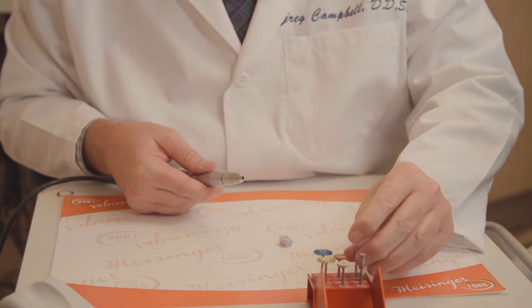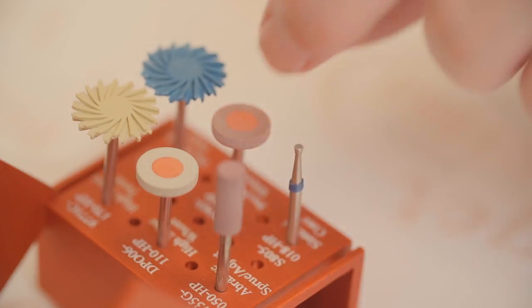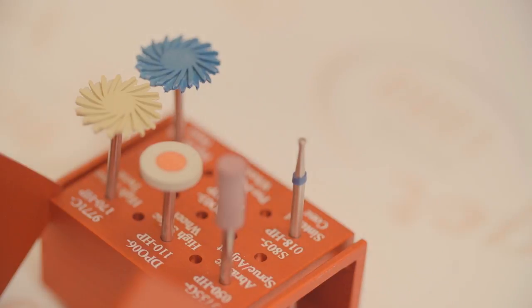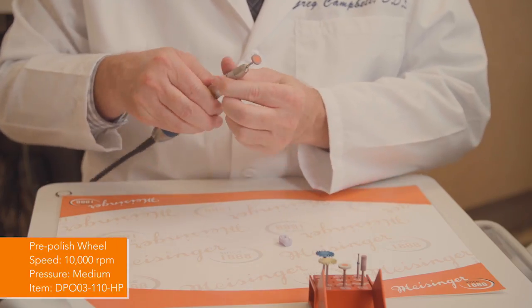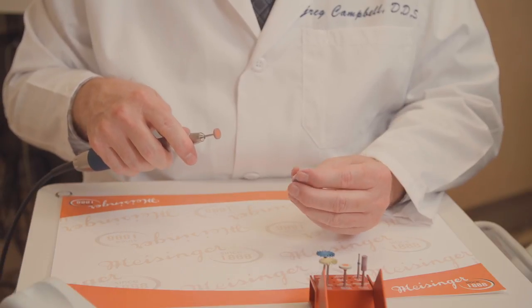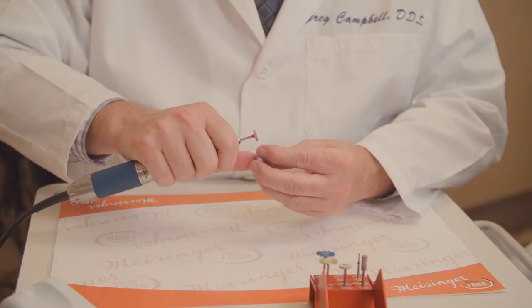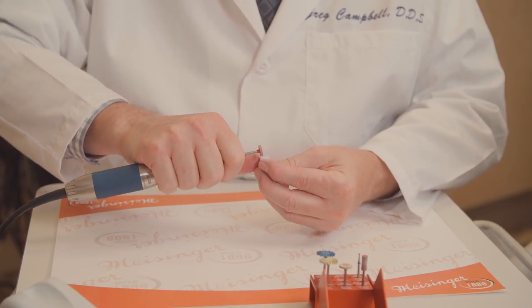Once you've defined that with your centered cone, now you're ready to go into the middle section here, the bottom row. You're going to go to the pre-polish wheel. This pre-polish wheel I like to use on the broad surface areas. I do not use this on the mesial or distal contact. You want to not do that because you want to protect your proximal contact strength. So we're going to use this on the buccal, the lingual, and the occlusal.